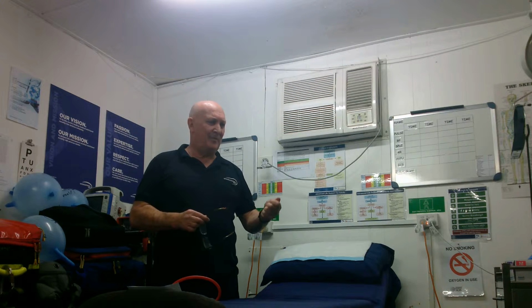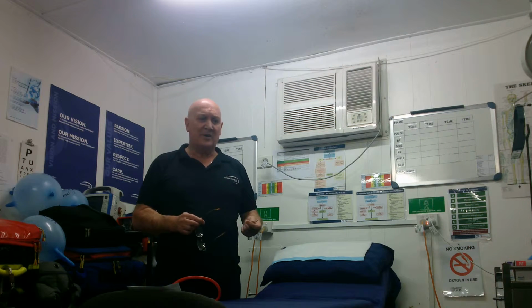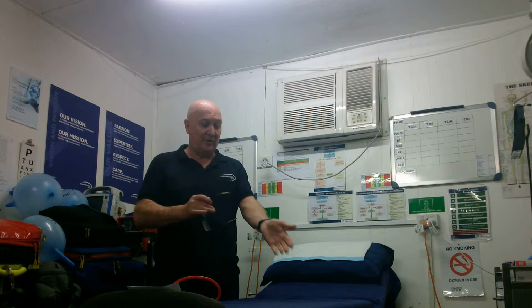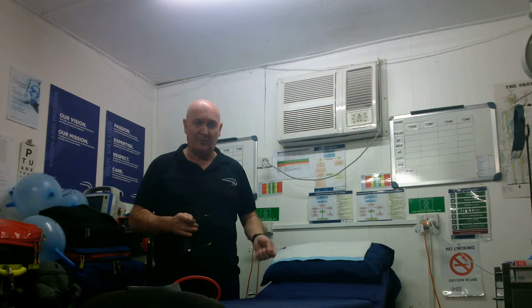Well, from the patient's clinical stage, we have to have an evidence base of how they are. We collect observations: blood pressure, oxygen saturation, pulse, heart rate, ECG. So blood gases add to that type of point of care assessment. So that's why we do it. They're performed by a trained physician. Either the radial, the brachial, or the femoral area is accessed to draw off the blood.